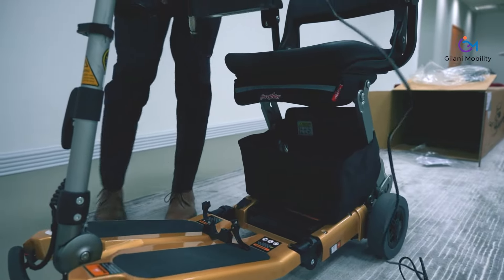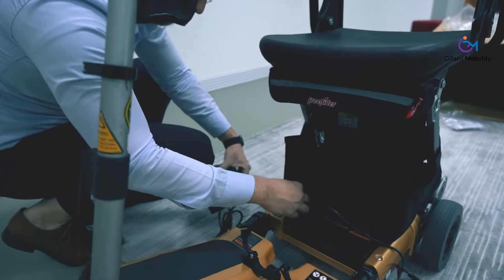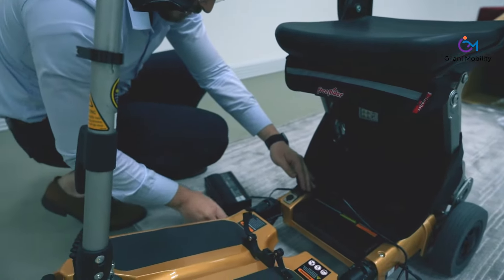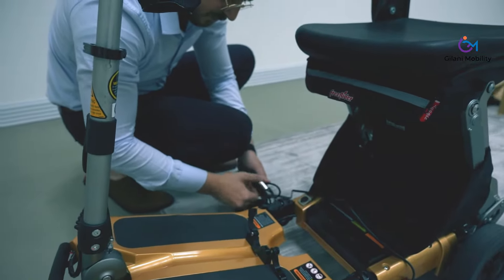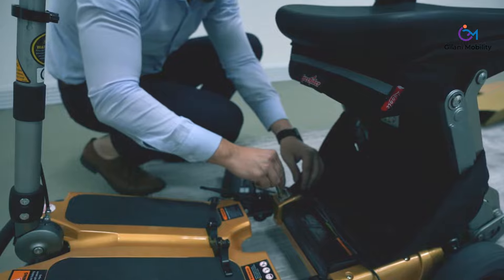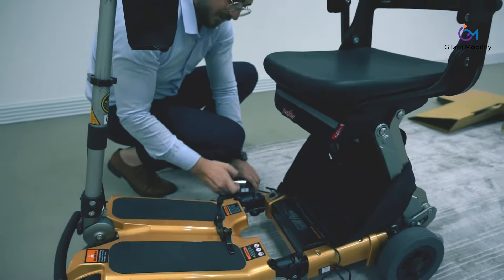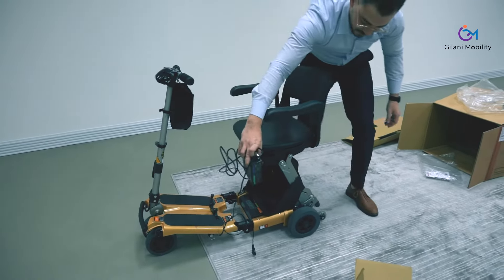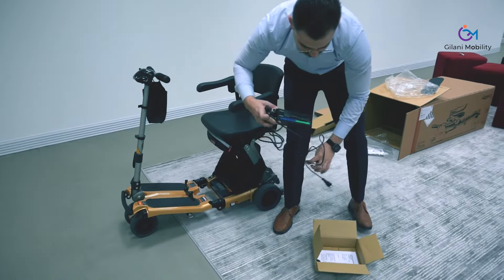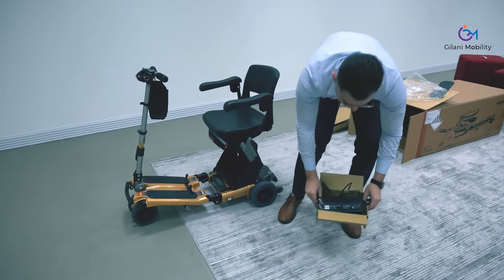The charging port for your battery is conveniently located on the scooter frame right underneath the seat on the right side. When you reach your destination, simply plug it in and let it charge. The charger will indicate when it's fully charged and will automatically stop charging, so you don't need to worry about overcharging.